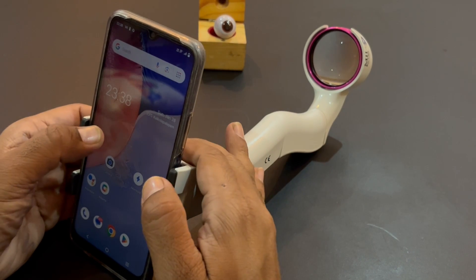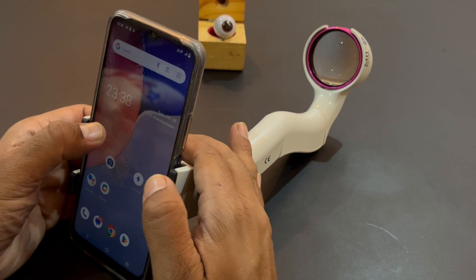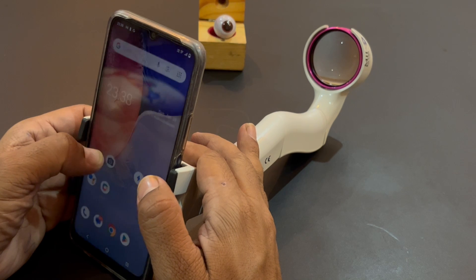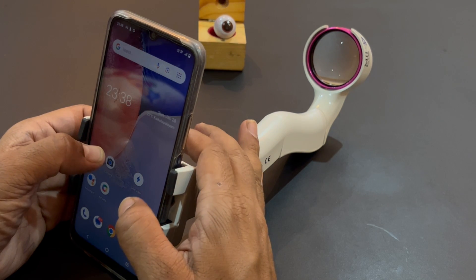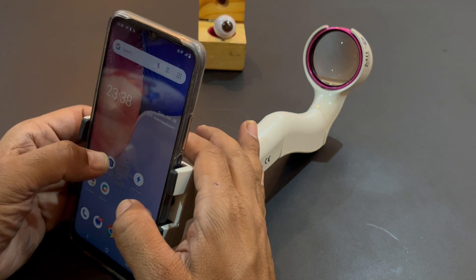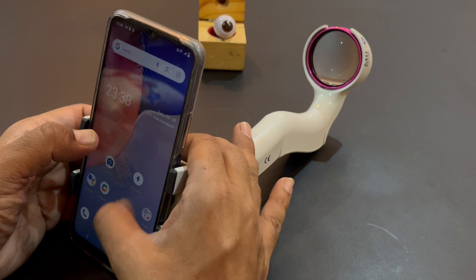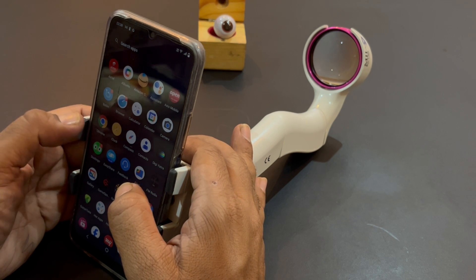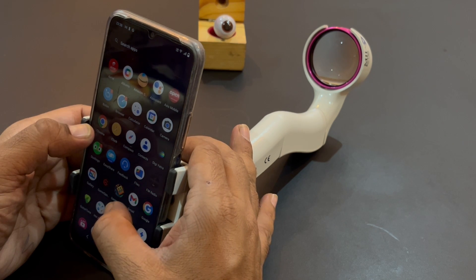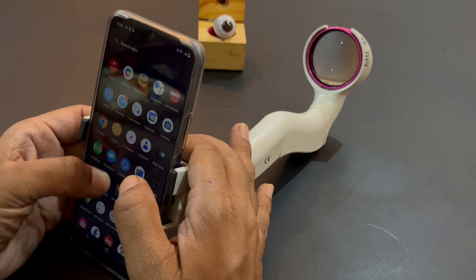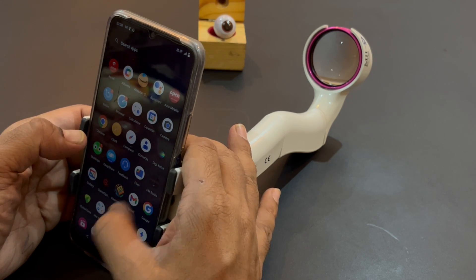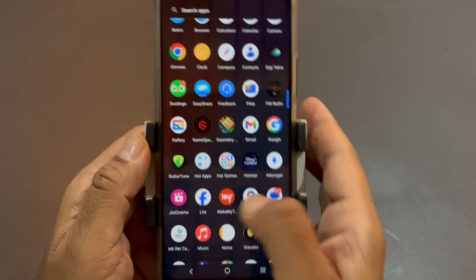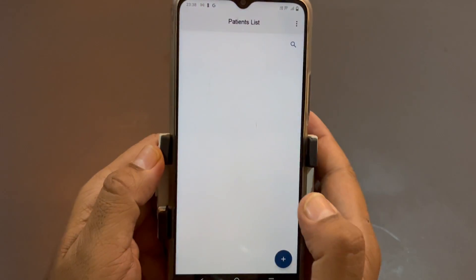Hi dear friends. In this video I would explain the functionalities of our latest Mi RedCam Pro Android app, which is available on the Google Play Store. You can just go there and type 'Mi RedCam Pro' and download it. I have already downloaded it, so this is right here.